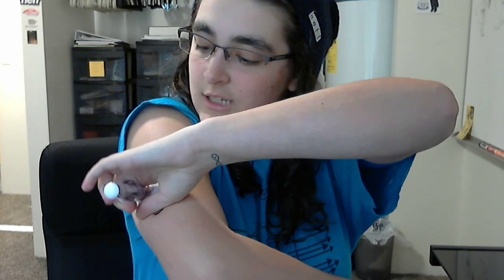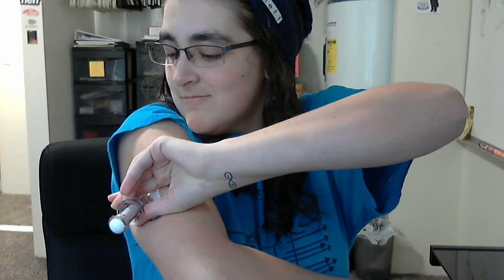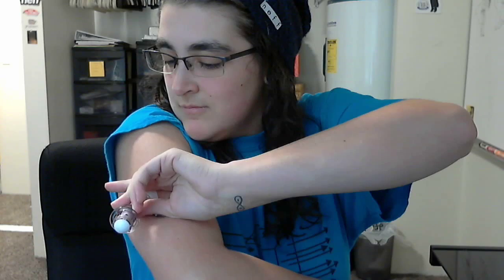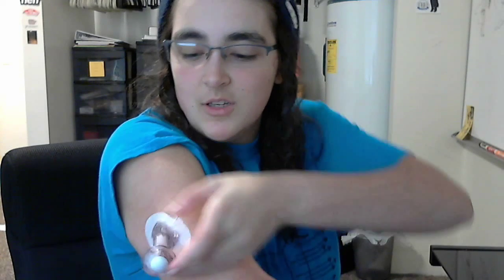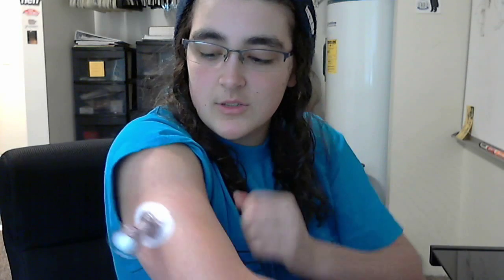I think I just accidentally messed this up. Not working this time. Just kind of push that off. I accidentally took off what's supposed to help put the transmitter in, so I'll have to do that manually. But same thing here. Push up. I either push down and push up with these fingers, or when it's higher, it's easier to push up with my thumb. But once it double clicks, the needle's out.